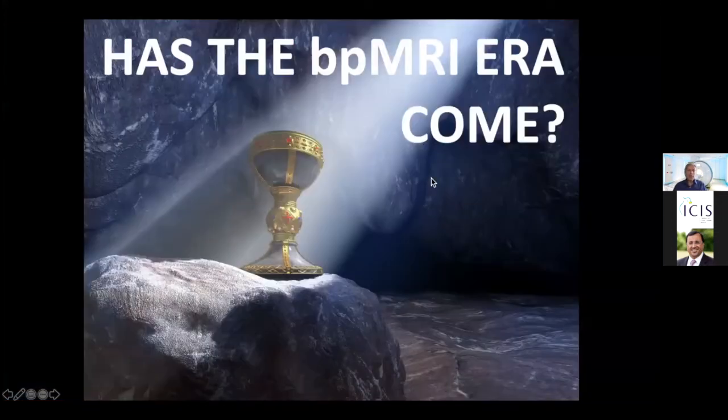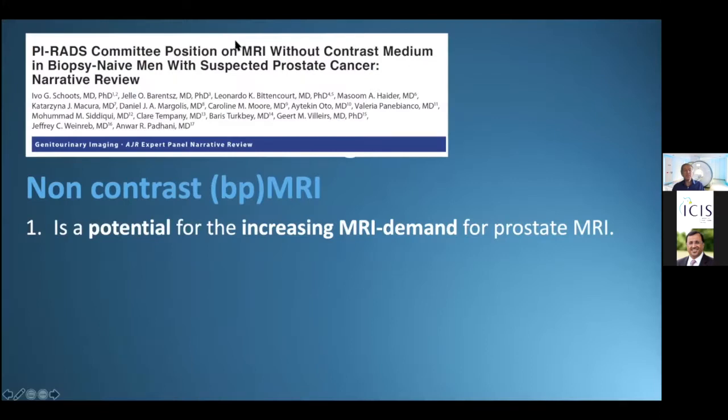Now the question is, has the biparametric era come? Well, the answer is: be careful. This is the advice of the PI-RADS Steering Committee, published in the AJR recently. Non-contrast MRI has the potential to meet the increasing demand for prostate MRI. That's recognized by the PI-RADS Steering Committee.